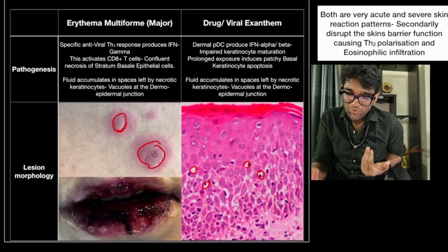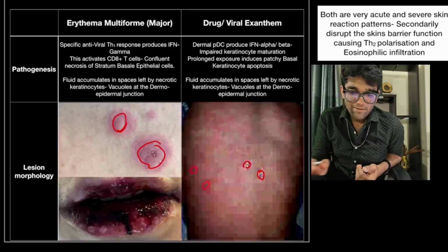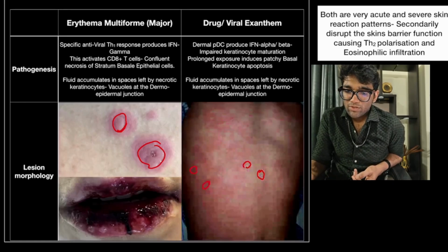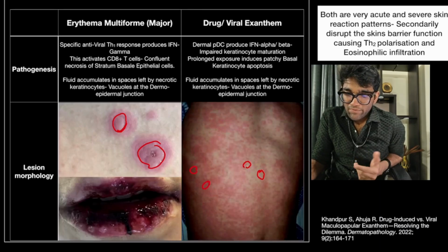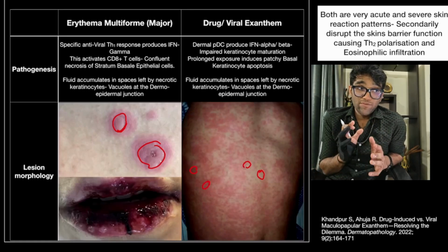Some holes don't, some holes do. Okay, and it looks like this. It looks very similar to your subacute cutaneous LE or this thing. Okay, so these are the two ends of the spectrum of interface dermatitis, pathophysiologically speaking.